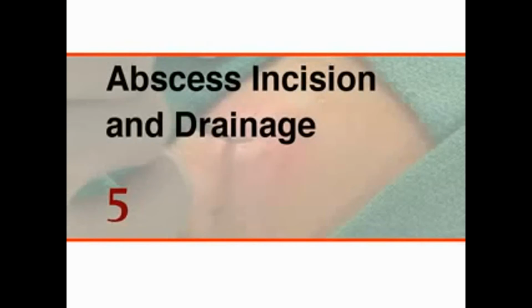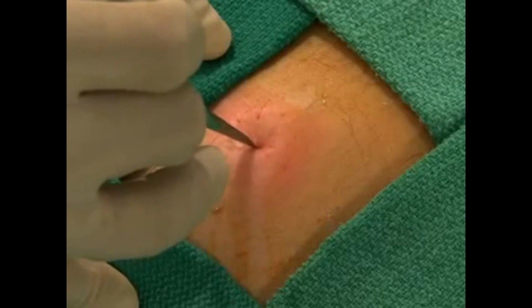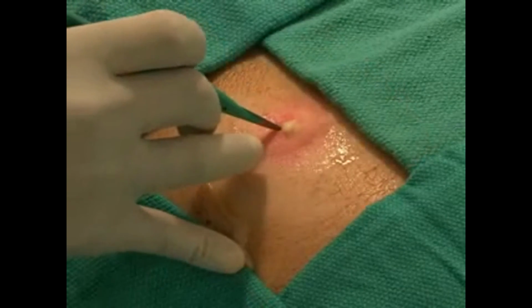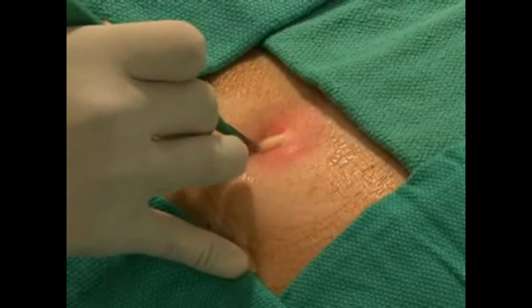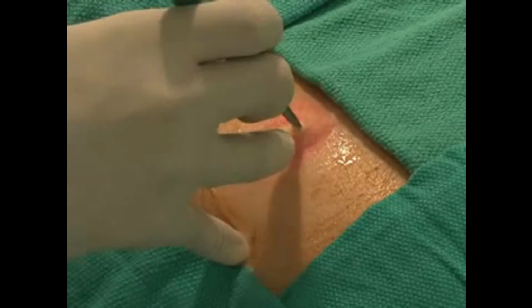Hold the scalpel between your thumb and forefinger. Make an incision directly over the center of the abscess that is oriented along the long axis of the fluid collection. Resistance may be felt as the incision is initiated, and steady firm pressure will allow a controlled entry into the subcutaneous tissues. Purulent drainage will begin when the abscess cavity has been entered successfully.